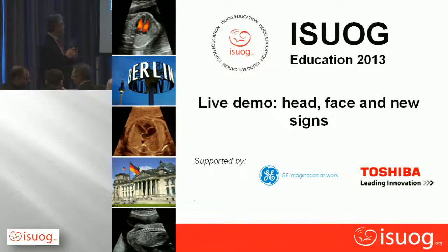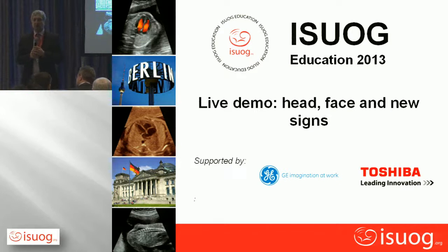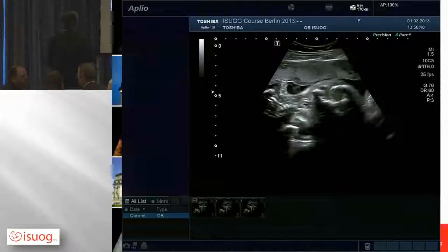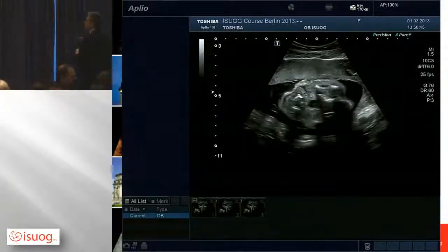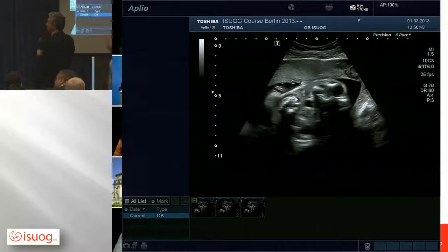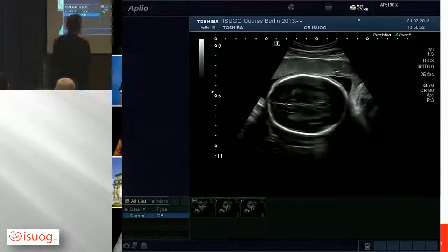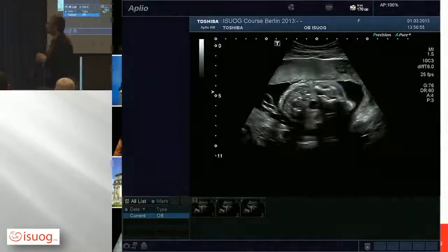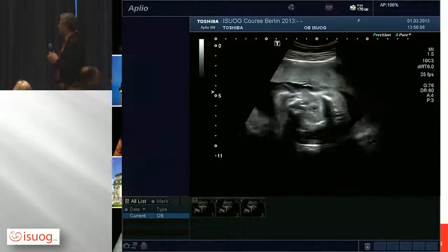We have two patients ready there, and we'll start with three people scanning. It will be Lucas Wilhelm, Gianluigi Pilou, and Bernard Benoit. So can we switch on to the ultrasound and the lights down, because it's as dark as you can. If you can eliminate all the light, it will be better, because there is no speaker in the front.